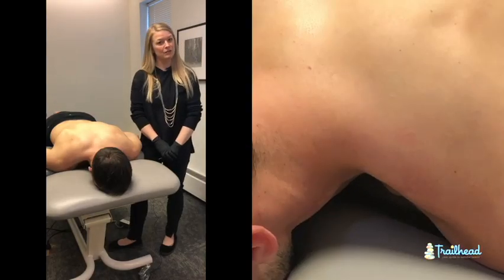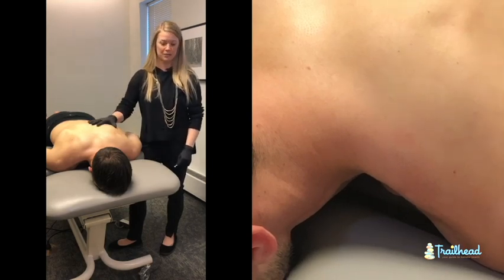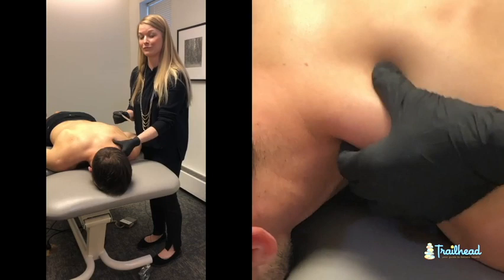Hi guys, today we are going to do a demonstration of dry needling and Mike has graciously volunteered to be our volunteer today. We are going to be needling his upper trapezius which sits right on top of the shoulder.